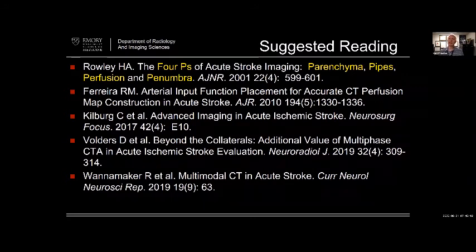I will say that when it first started to become popular, I was trying to figure out what I would say in certain situations. I think it's akin to when I look at a non-contrast head CT and I'm trying to figure out if I can see the infarct or not. How does it factor in when you use the stroke windows? And how does it factor in when it's somebody who has a whole lot of experience looking at stroke versus somebody who doesn't? Those kinds of things.